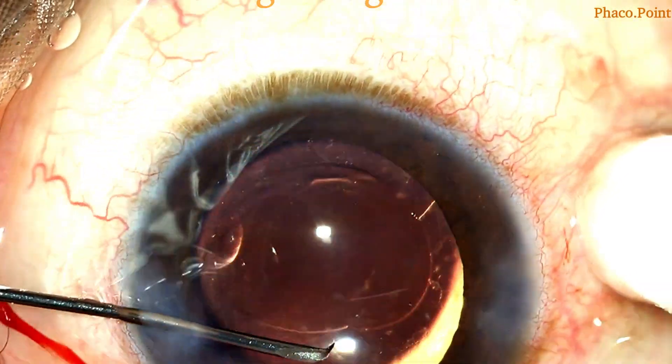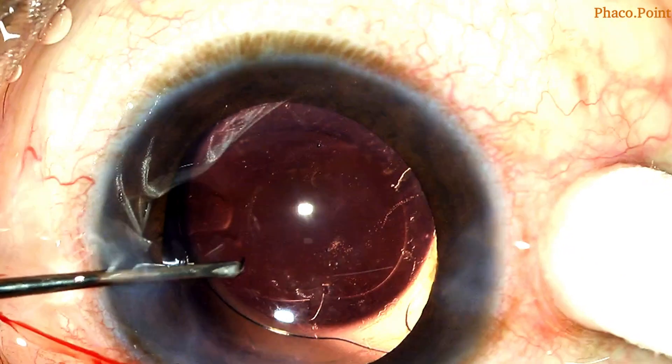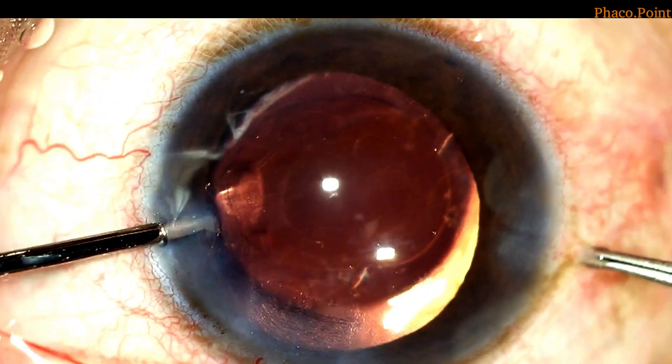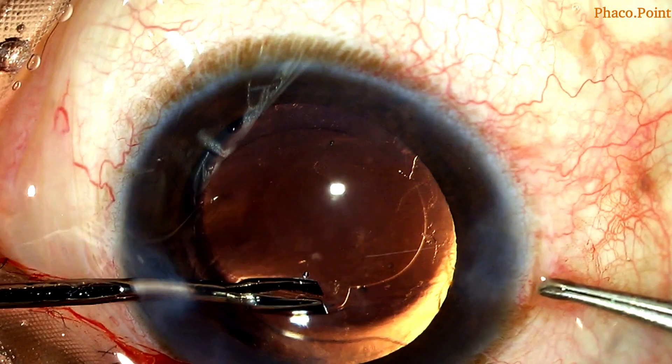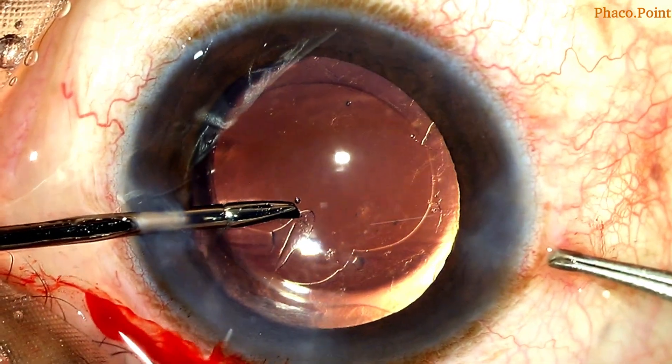Under viscoelastic cover, a cystotome is introduced into the anterior chamber and a nick is made in the anterior capsule. The lack of the underlying nuclear support can make this challenging. Once achieved, one of the torn edges is held and, in a circular manner, note how the tear is extended.